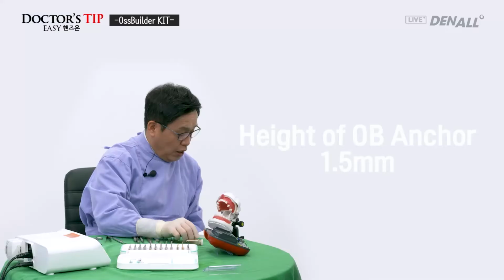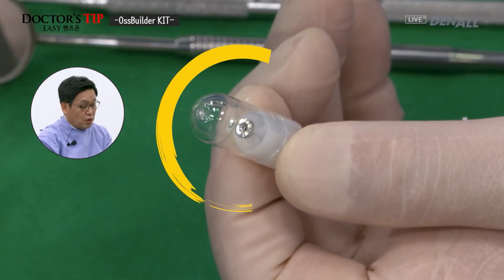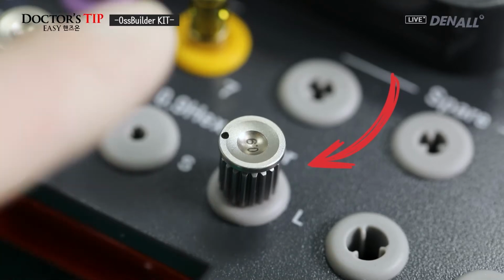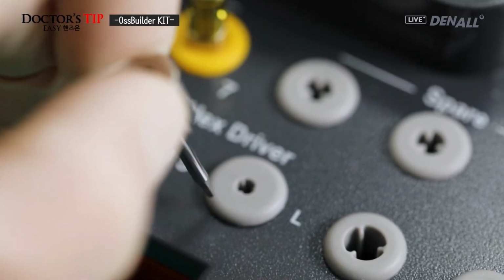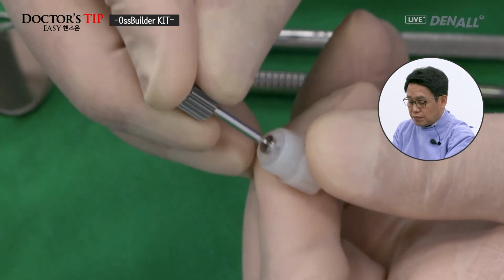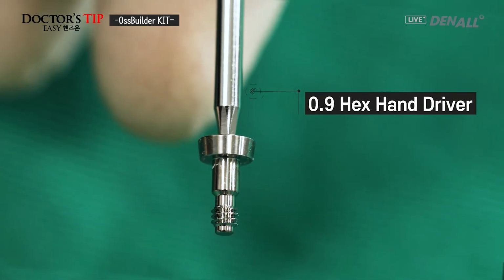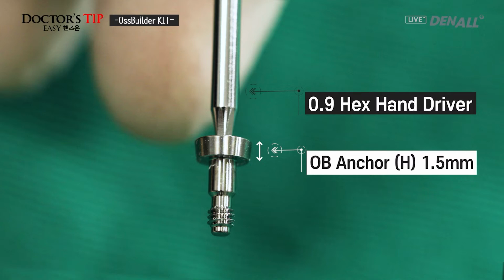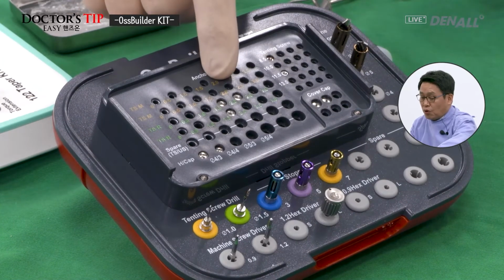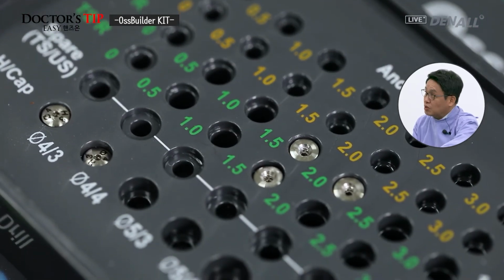The anchor height of the OB anchor is 1.5 millimeter. When you prepare the OB anchor like this, there's separate packaging. I'm going to use a 0.9 hex driver. Using this driver, the anchor is going to be removed. On the 0.9 hex driver, you can connect the OB anchor. If necessary, on the OssBuilder KIT, there are different heights of anchor. You can get them ahead and select your choice.